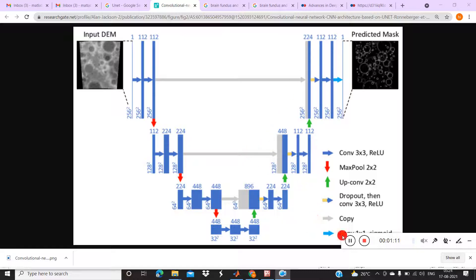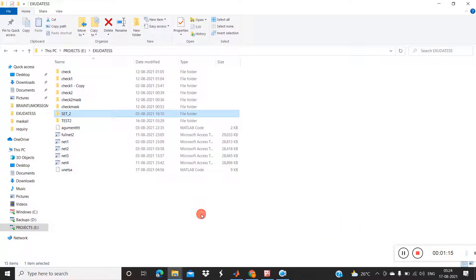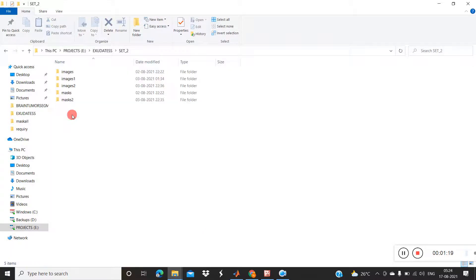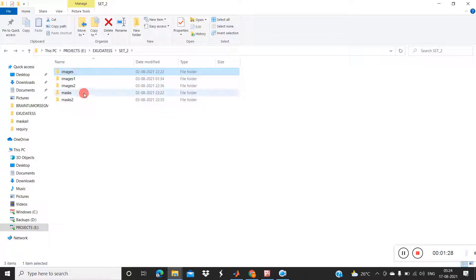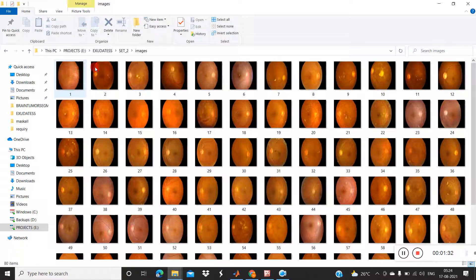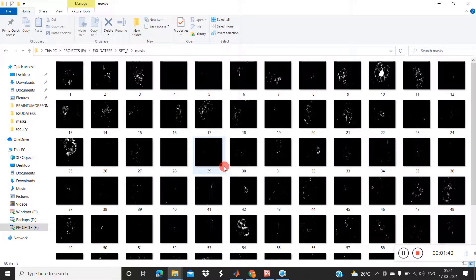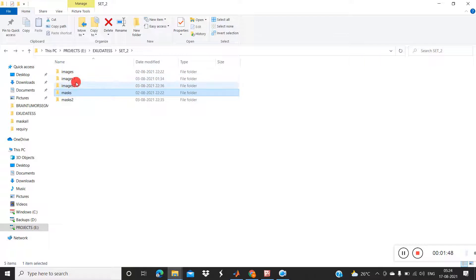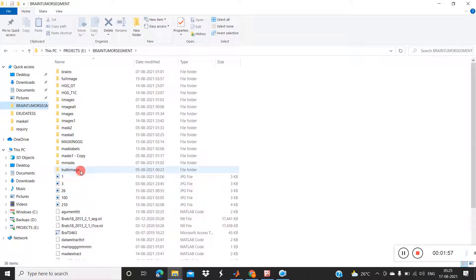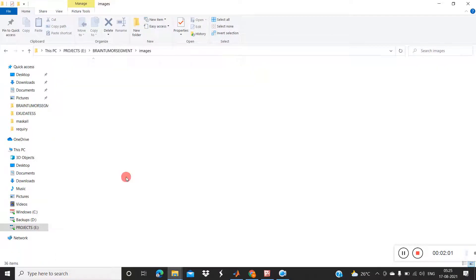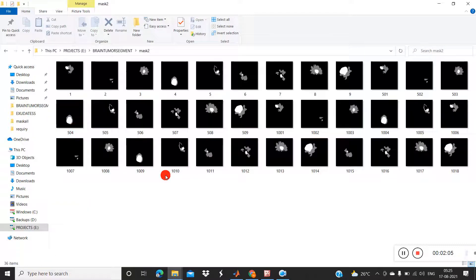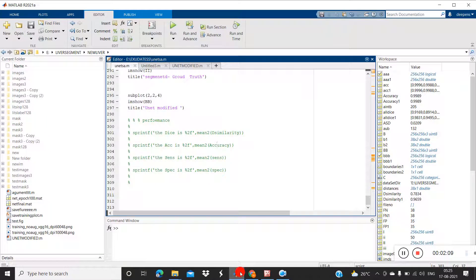I will show you how to do that in MATLAB. First, create one folder, keep any name, open the folder, and create two more folders. Name these 'images' and 'mask'. Put the original images inside the images folder and the masks inside the mask folder. Keep all those files inside the corresponding images and mask folders. For example, here I have taken the fundus images, but likewise you can take brain tumor images and their corresponding masks.